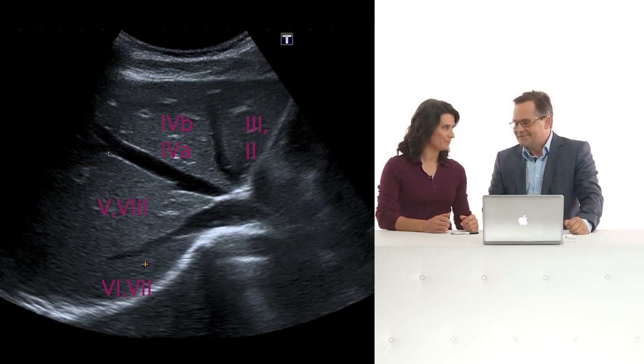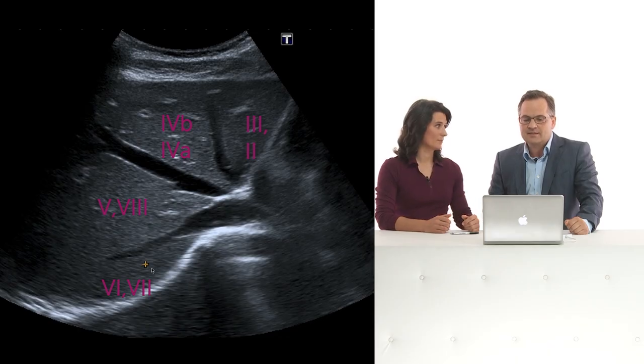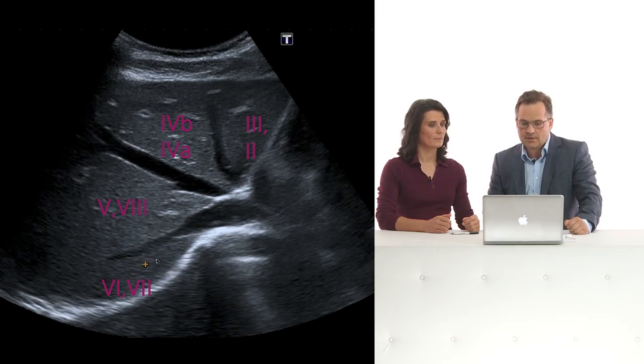Because it's more caudally. The right liver lobe contains the liver segments 5, 6, 7, and 8. So we can see liver segment 6 and 7 in this part. And in between the middle and the right liver vein, we can find liver segment 5 and liver segment 8.